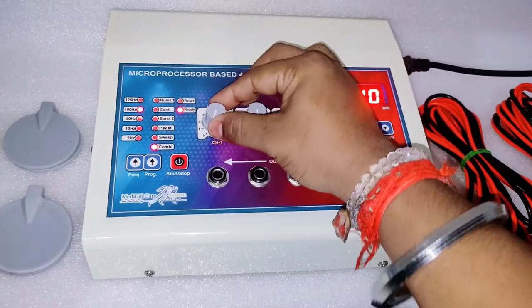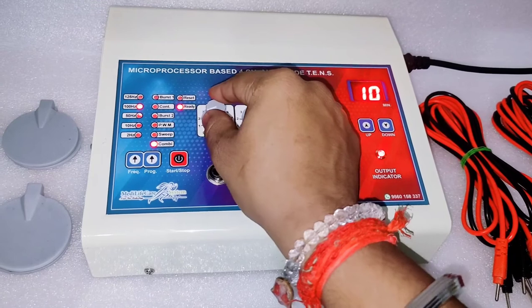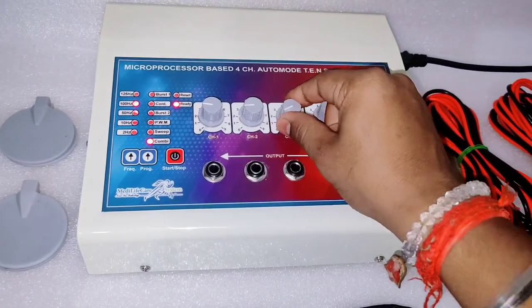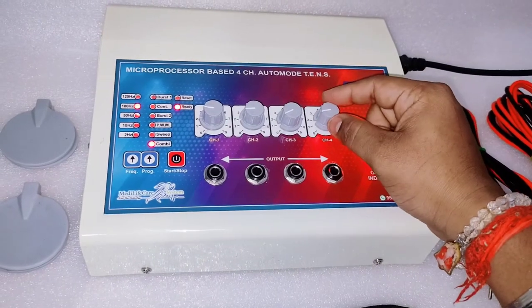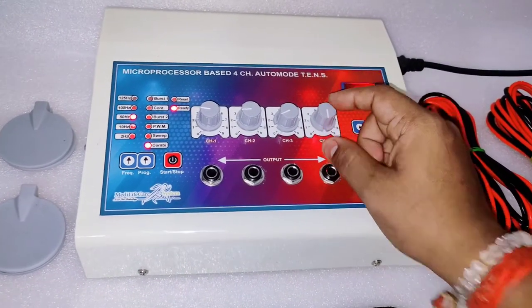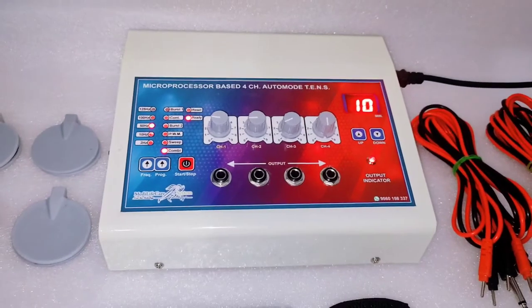Then start the knobs: knob 1, channel 1, channel 2, channel 3 and channel 4. This is the demonstration video for the Automode 4 channel TENS.